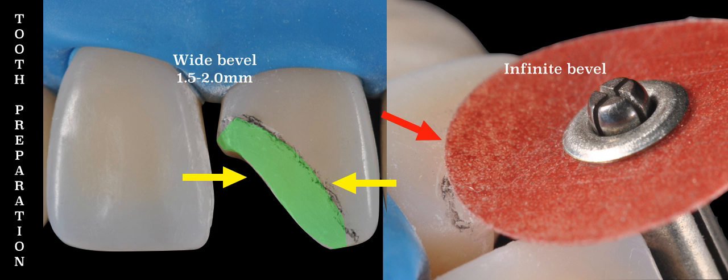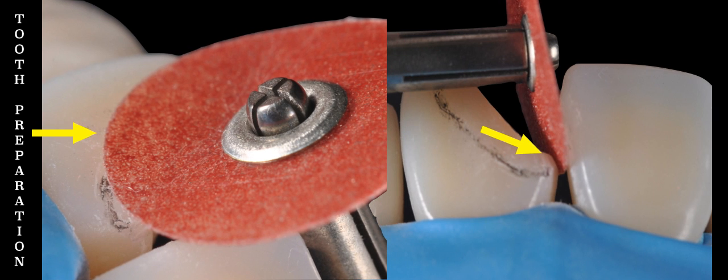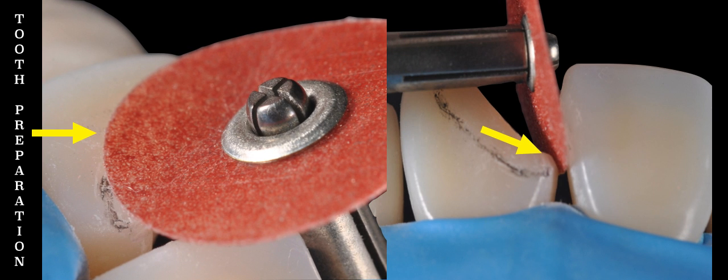But our fully aesthetic bevel is not done yet. Once we are done preparing our wide bevel, we are going to create our infinite bevel. We are going to polish the finish line of this bevel so that it is invisible and has a soft transition with the unprepared tooth structure. We are going to round off any sharp edges, and we achieve this by using a coarse disc on a slow speed handpiece.